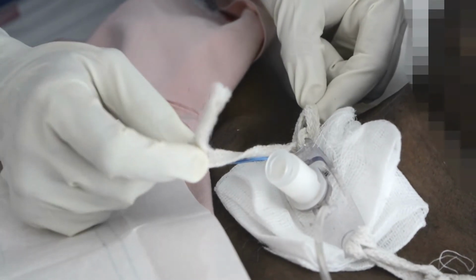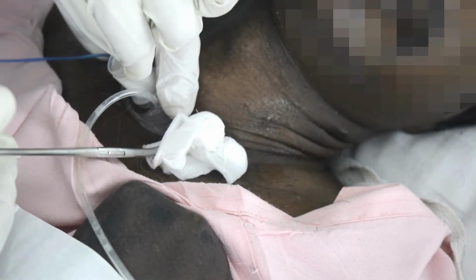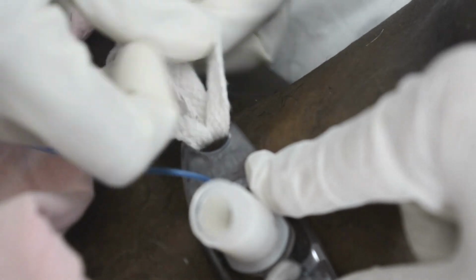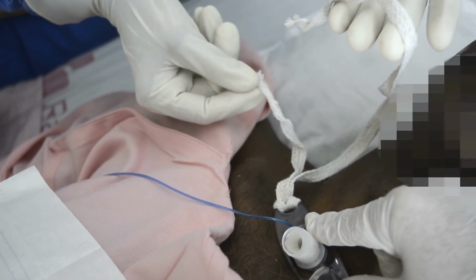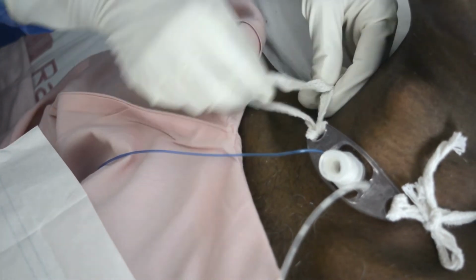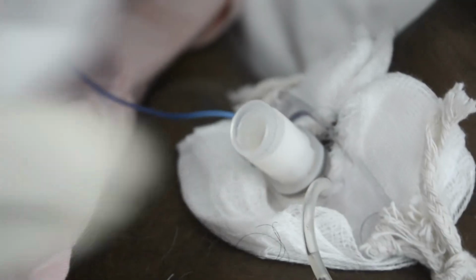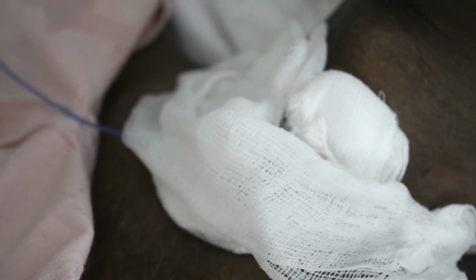Remove the twine carefully. Always take assistance. It is a two-person procedure. One person has to secure the tube flanges with 2 fingers. Ensure that the cuff is inflated at this time. Tie up the twine carefully. The 2 ends should be like one end shorter and one end longer. The shorter end should be tied to the longer twine of the other side, and it should be 1 finger tight. Now cover it with wet saline gauze. This is for humidification, and this makes the general tracheostomy care complete.